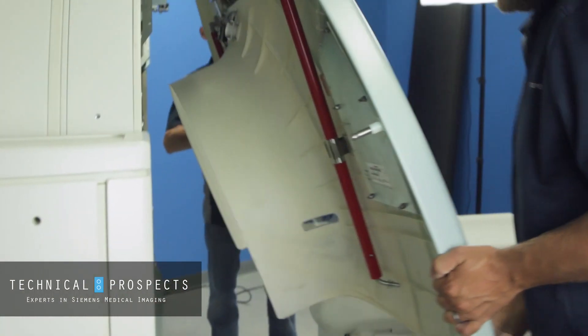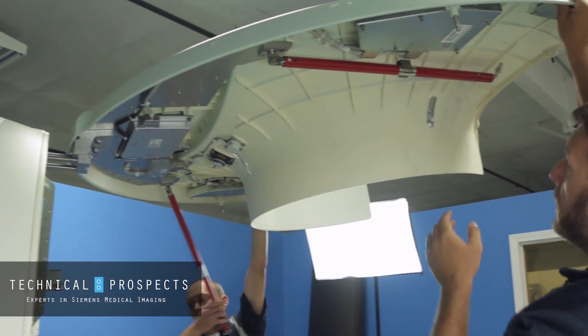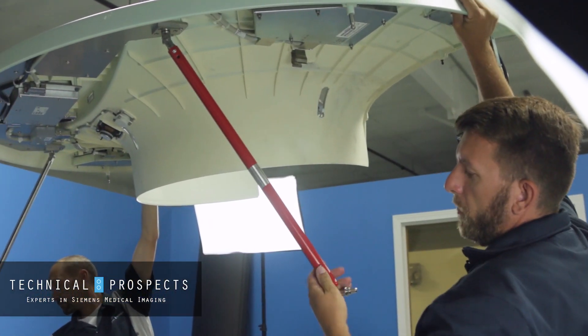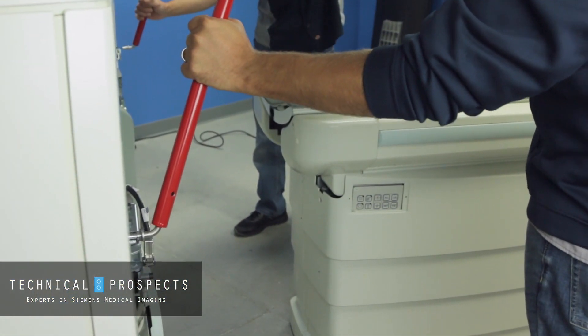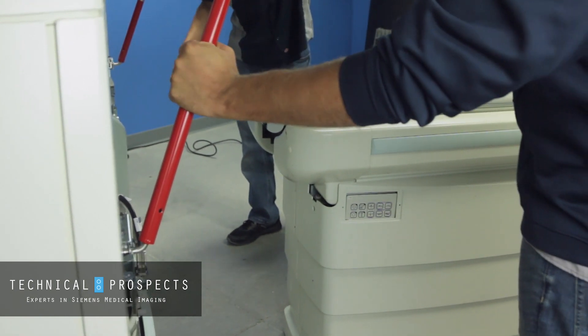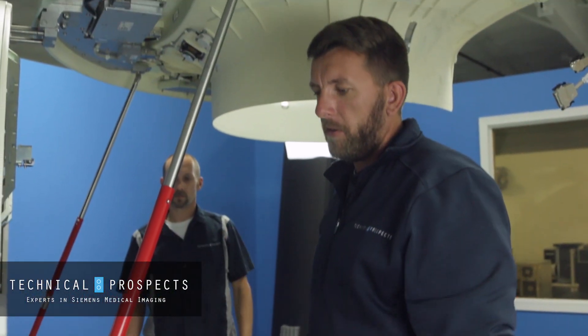At this point we're ready to lift the cover up. You'll notice on this older style cover there are retractable rods built right into the cover that you spin and lock into place. Now we're locked in and we can safely access the top part of the system.